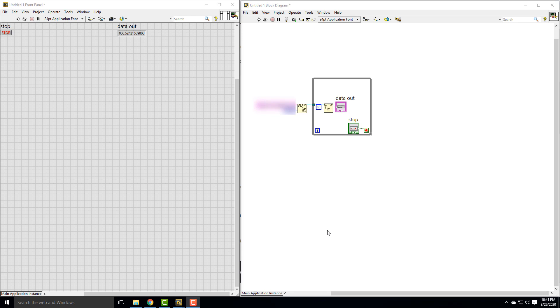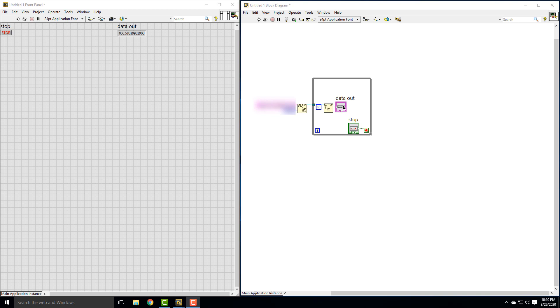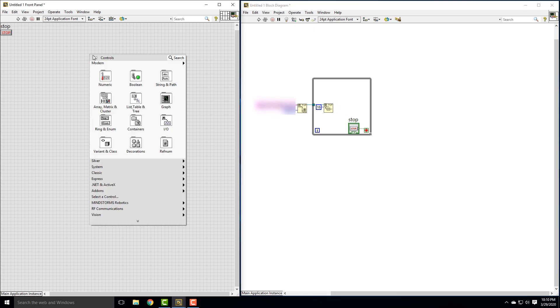Hi everybody, it's Dr. Dan. I'm back to continue our discussion on how we can collect data over the internet using TCP and LabVIEW. We left off last video just displaying the data as numbers in the data out field. We actually want to see what our ECG data looks like, so instead of just displaying numbers, we're going to make a graph.